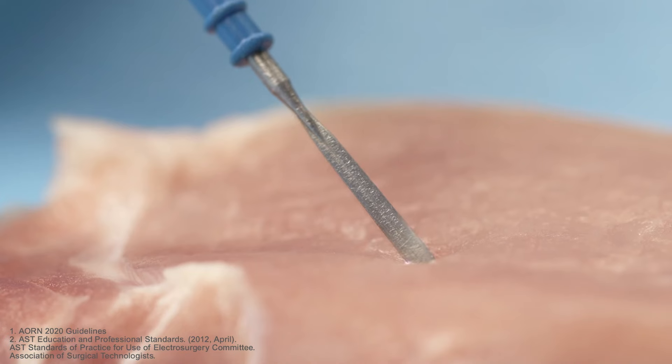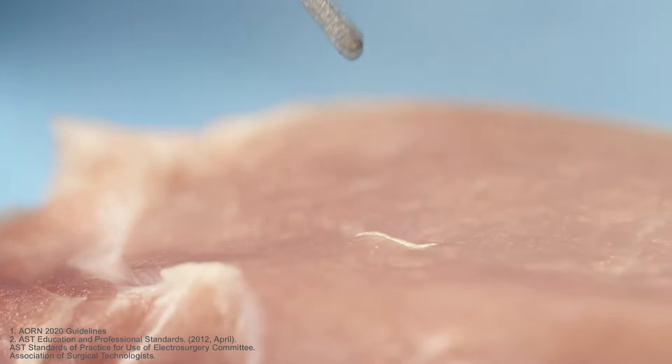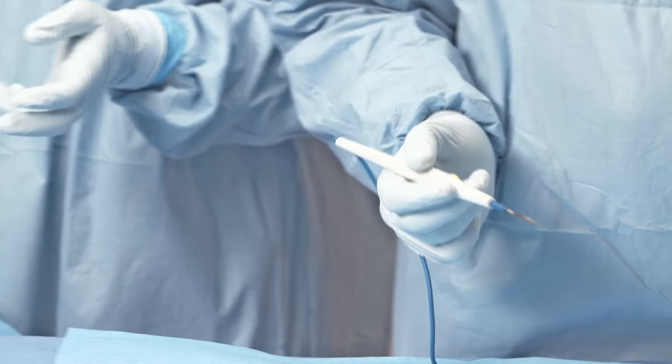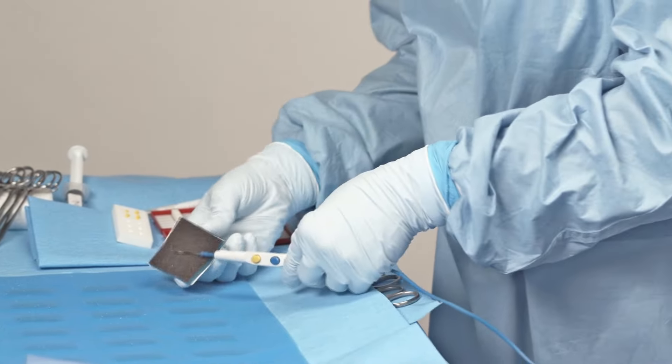When using uncoated electrodes, eschar can quickly build up, causing an increase in surgical smoke, inhibiting device performance, and ultimately leading to continual handbacks that unnecessarily prolong a procedure.